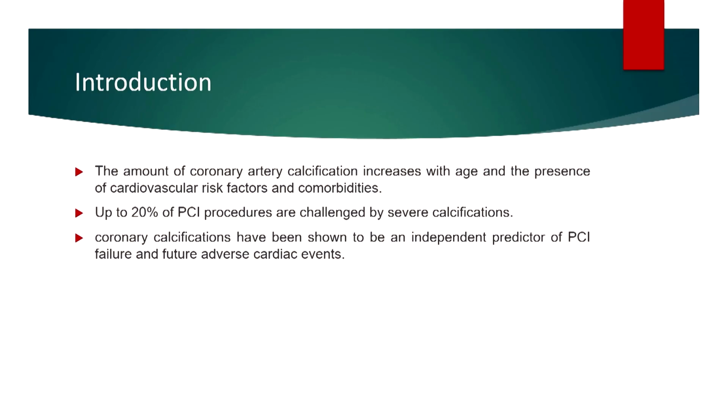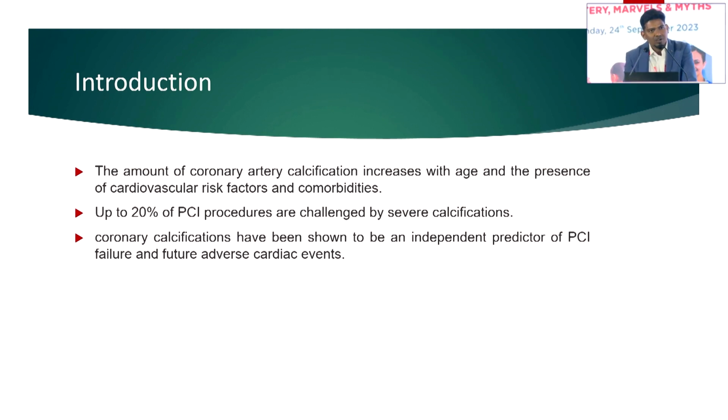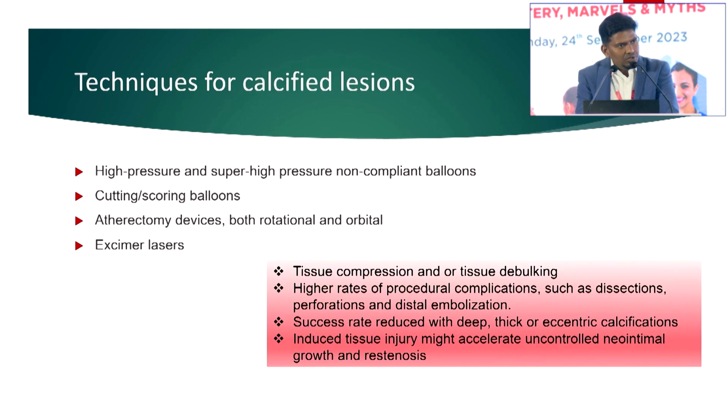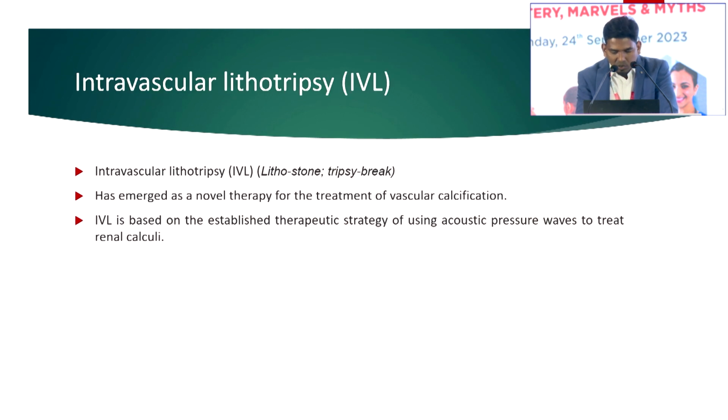So from morning we are talking about calcium always. Once upon a time it was, oh my God, calcium, how am I going to tackle it. Nowadays, oh, calcium, we can take care of it. For interventional cardiology, before going to the procedure, it is very important to have a clear plan about what you are going to do and what instrument you are going to use. So you can expect the complications in the procedure and how you are going to tackle them. If you have that in your mind, then it will be very easy. If there is calcium, there is a 20%. Most of the interventions are very difficult with calcium.